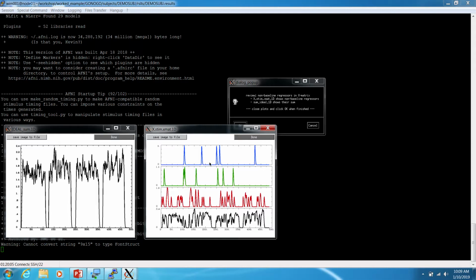So you notice these blue and green regressors happen more rarely. What happens down here is more elaborate. So these are overlapping events. So our actual graph, we have many events occurring next to each other. And so a little bit at different times gets associated with different events. But what we're interested in is this event as a whole. So we end up with a graph that's counting different periods of activation differently into this regressor.